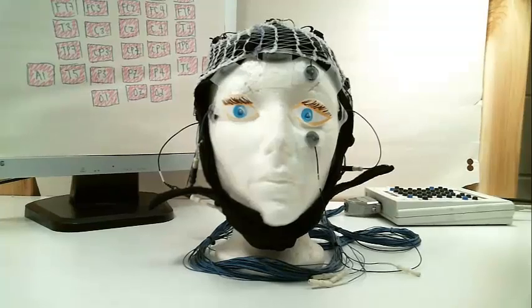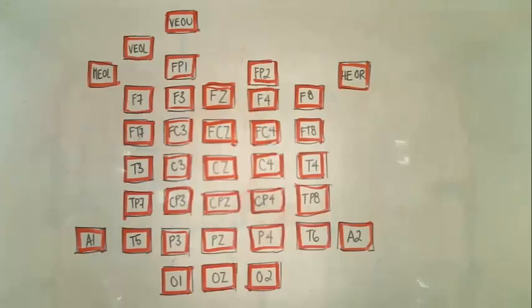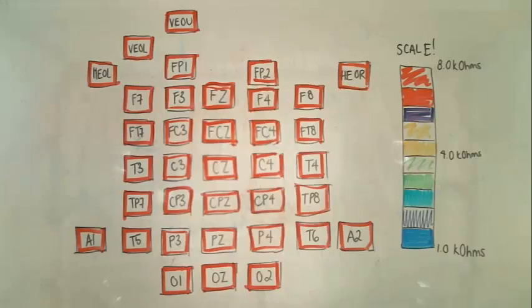The next step is to prepare the electrodes. Impedance is essentially a measure of resistance, so lower impedance means higher quality signal. It is important that the impedances be relatively the same. Impedances are represented visually by a change in color for each electrode on the screen. You can see that each box represents an electrode on the cap. Right now all the electrodes are pink because the impedances are high.